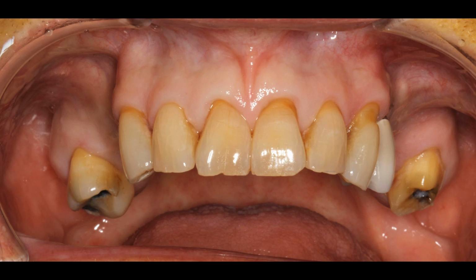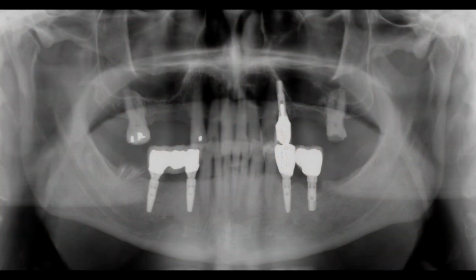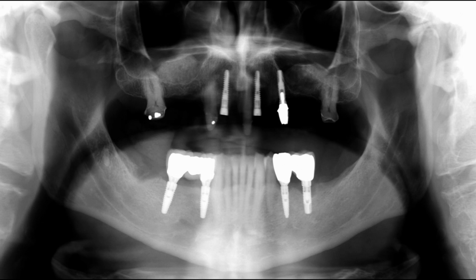So he needed bone in the back of his mouth. His was a prolonged treatment because we bone grafted his sinuses first. Here he is before any treatment here in Dallas. Here he is after the first sinus grafts, and I did place 2 implants.